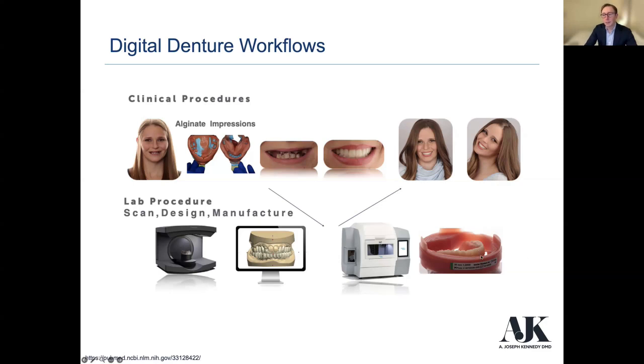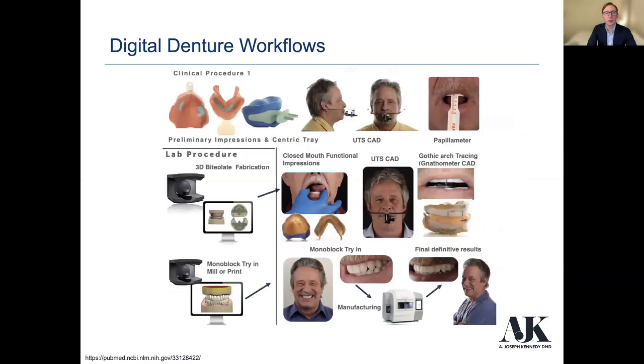PMMA pucks. They have different colors ultimately. You've got the pink for the soft tissue, and you've got the white for the hard tissue here, which is pretty slick. And then again, this just really takes it home with the digital denture workflow.